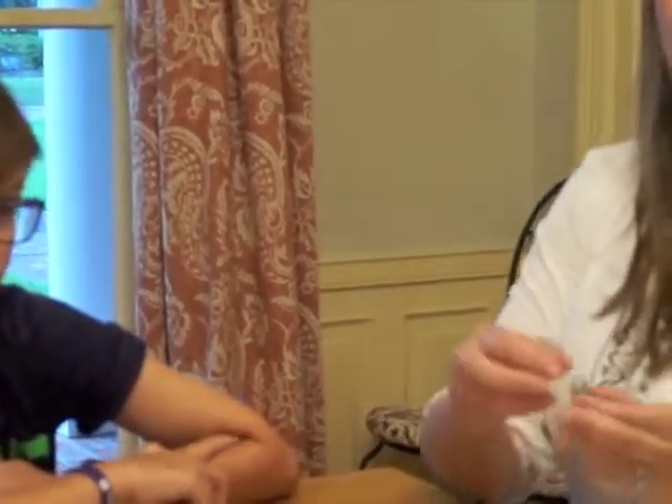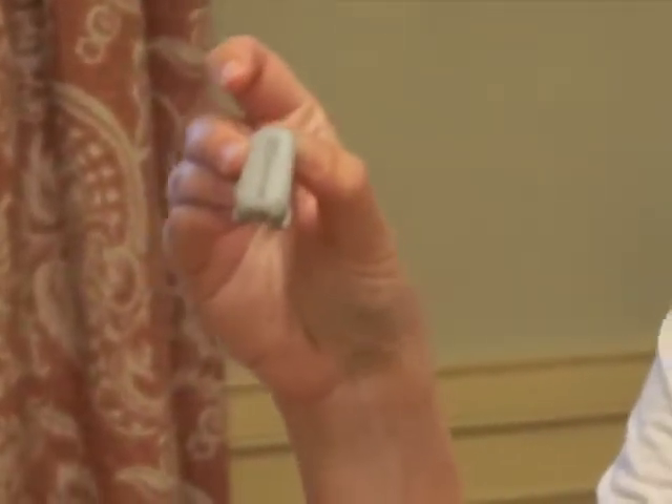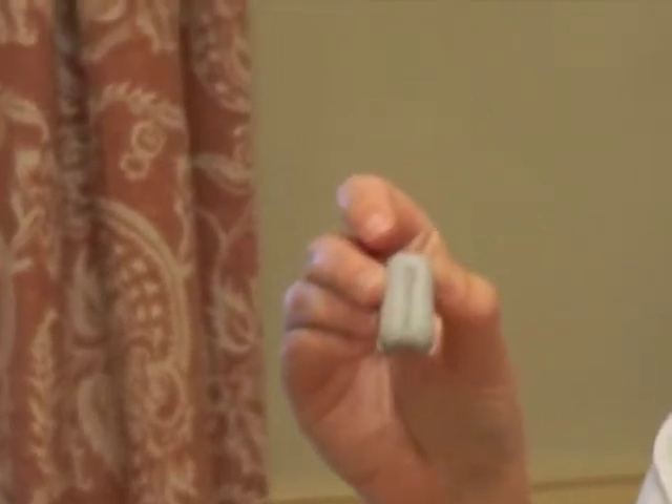Now the last step is to put the transmitter back on. The transmitter is what actually sends the information to his phone. We reuse the transmitter — it is good for 90 days — so we just clean it. This is actually the hardest part: putting it on, because you have to get it squeezed in just right. There's a little lever.